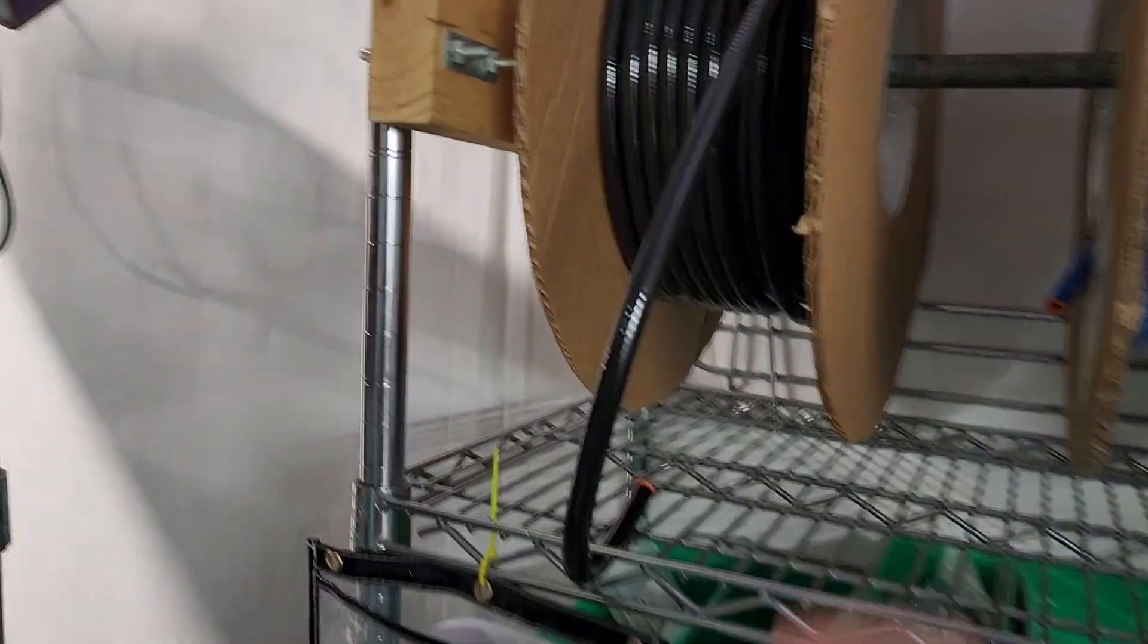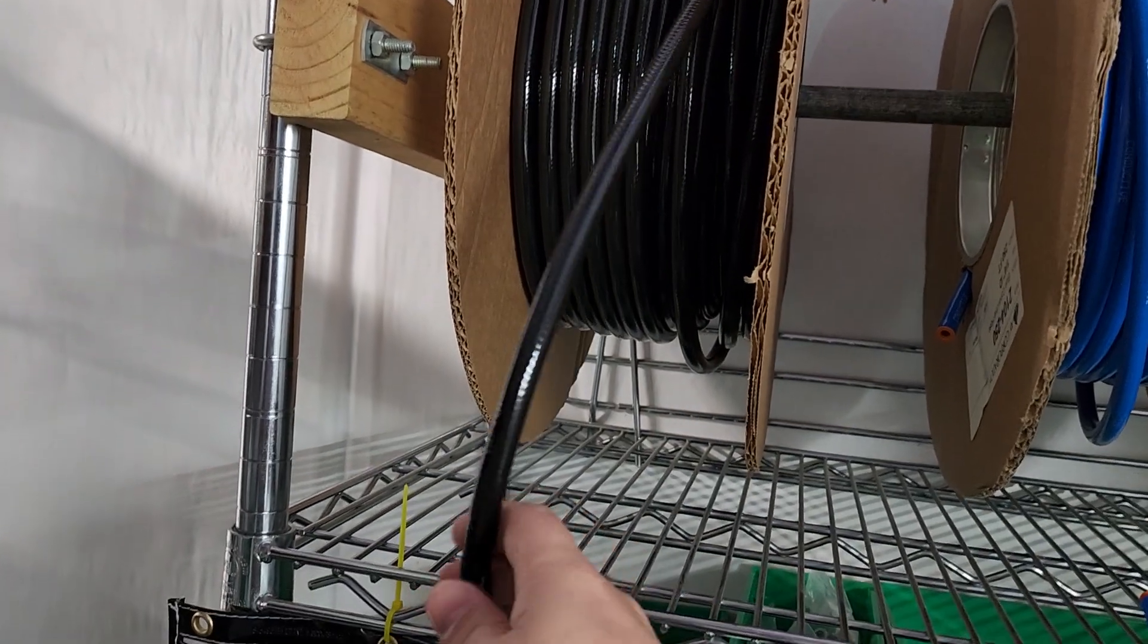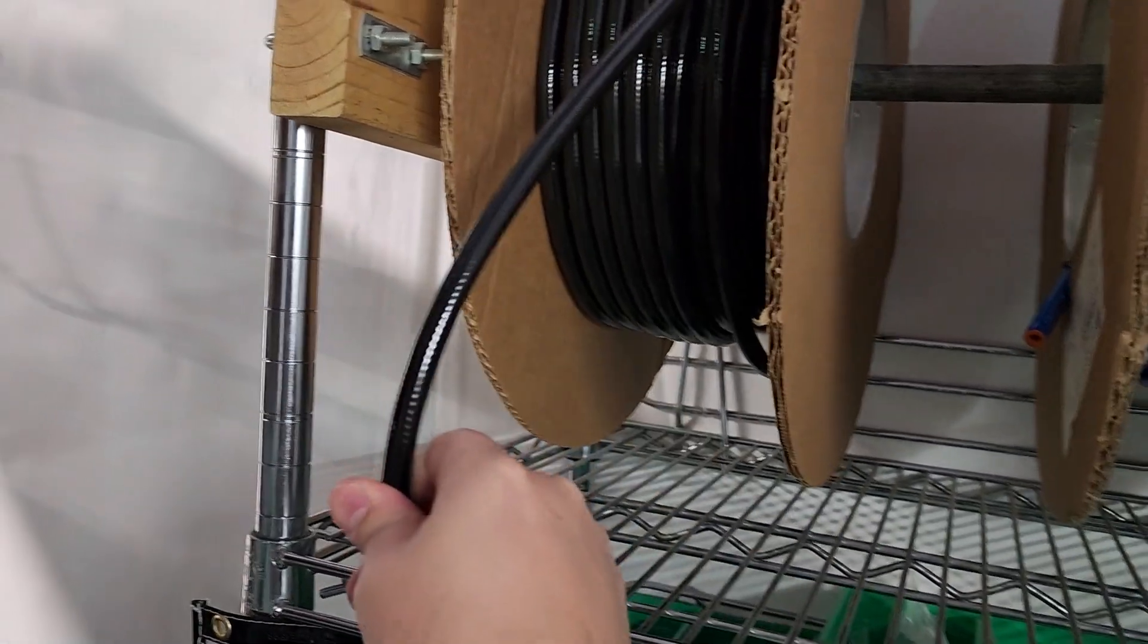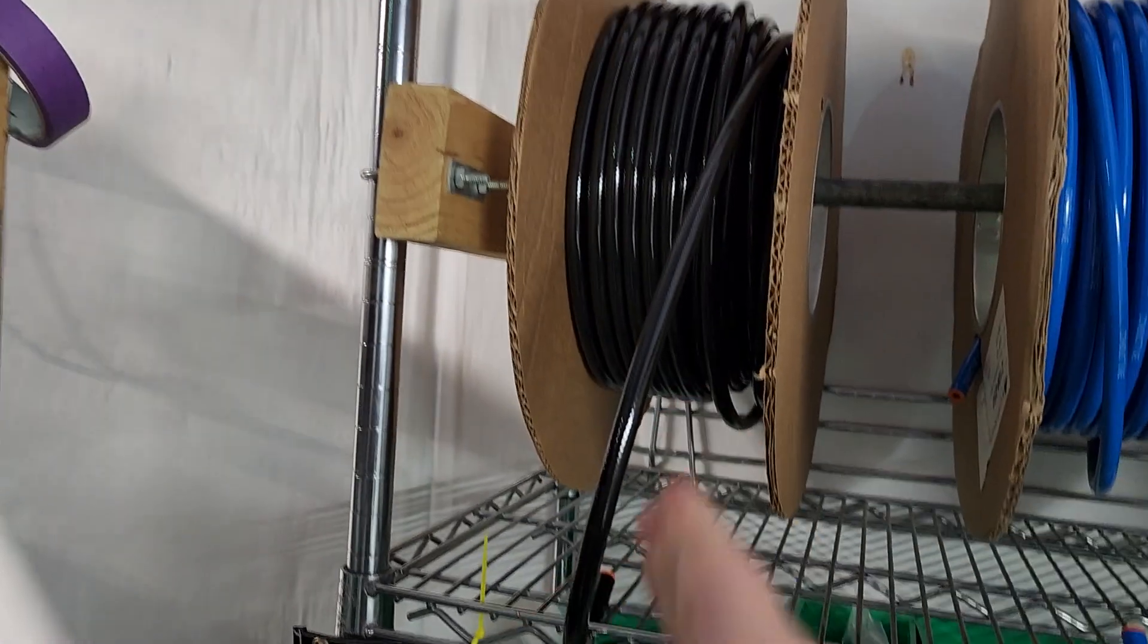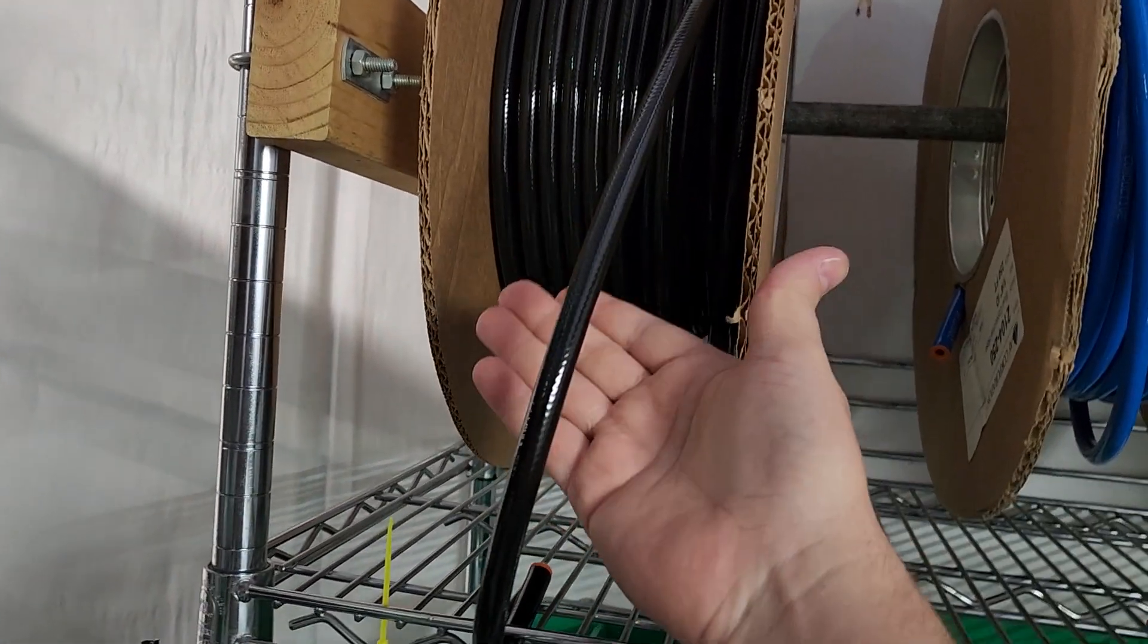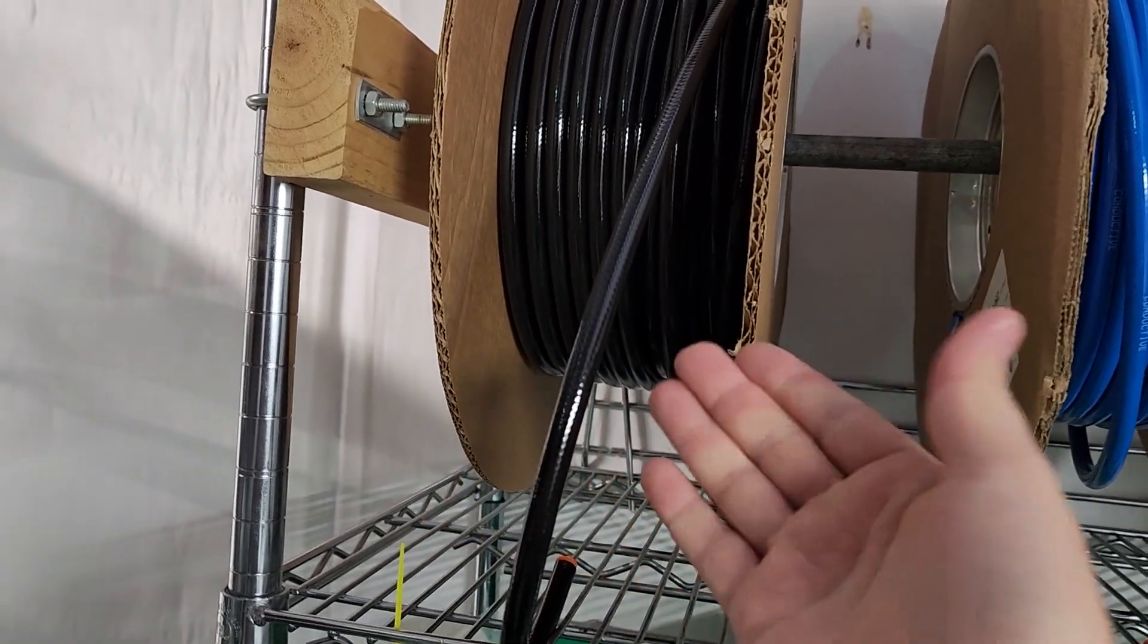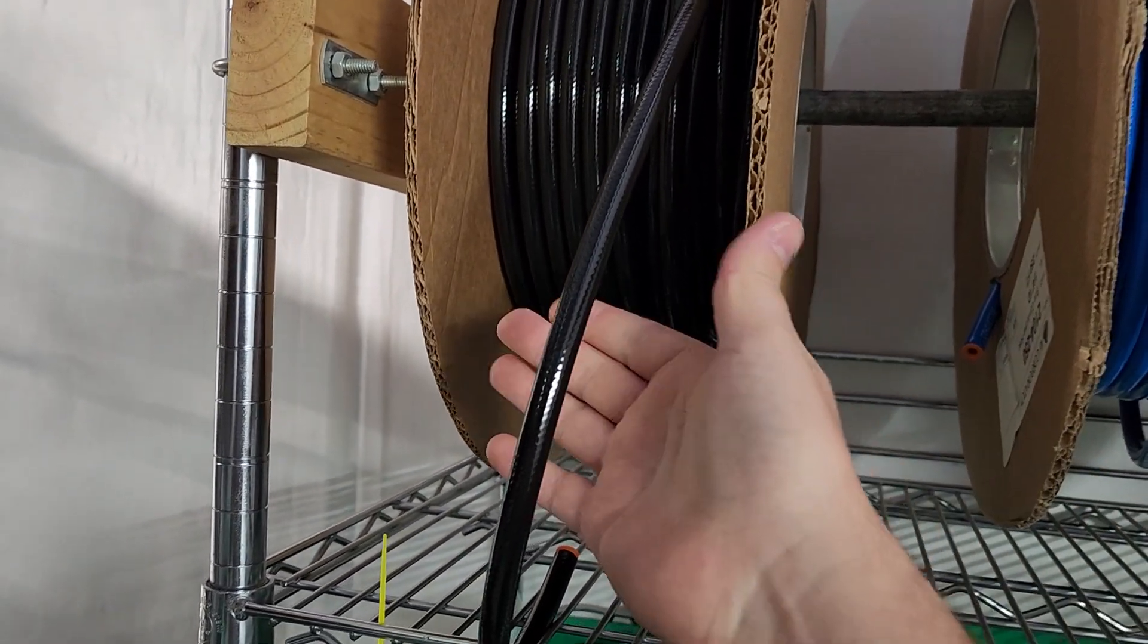Black is usually reserved for nitrogen. Nitrogen is usually used for powering instruments, especially for neurosurgery, because you can't use electricity around the brain. So often a lot of neuro instruments—saws and stuff like that, shavers—those instruments are going to be powered with nitrogen.